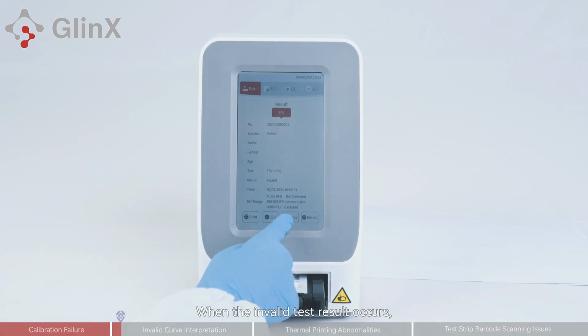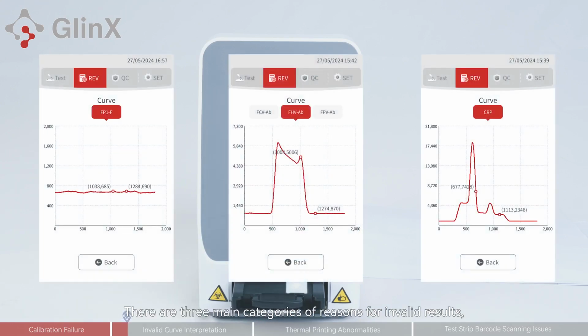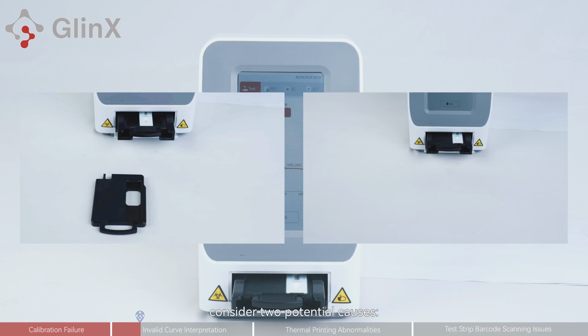When the invalid test result occurs, analyzing the curve can help identify the reason. There are three main categories of reasons for invalid results, which will be introduced one by one. Scenario 1. The result curve is a straight line, indicating that the sample did not initiate chromatography. In this scenario, consider two potential causes.